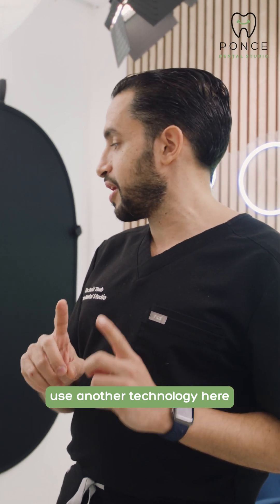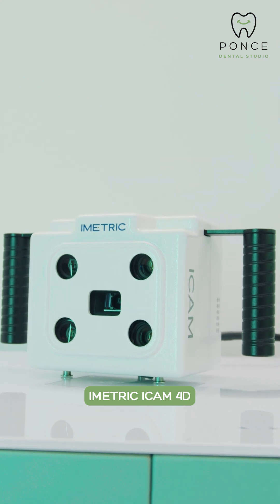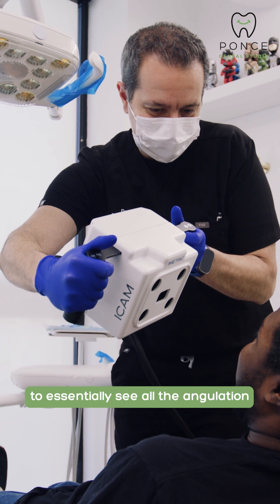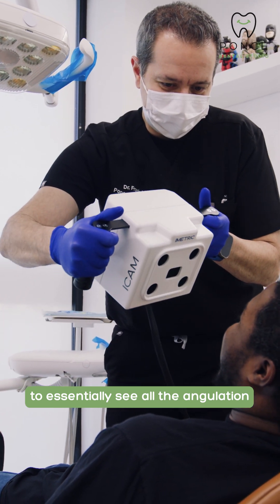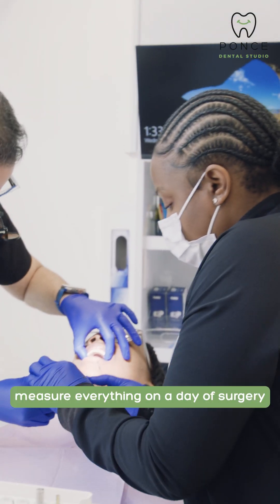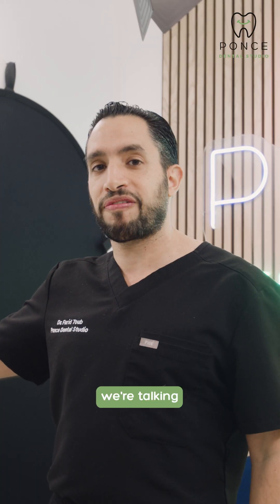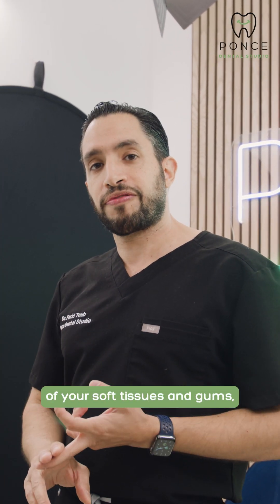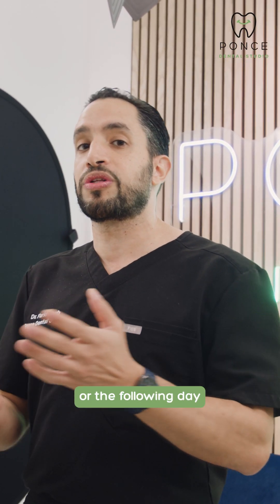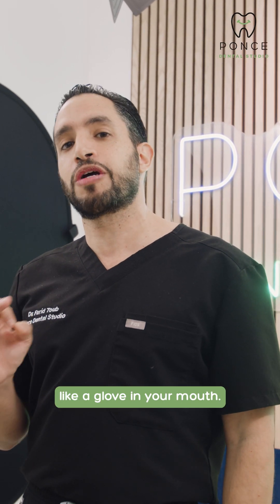We use another technology here that most other places don't have, and it's called the iMetric ICam4D. This tool is going to allow us to see all the angulation of your implants inside of your mouth, and it allows us to actually measure everything on the day of surgery and make our final adjustments. When I say final adjustments, we're talking final adjustments of your implant positions, of your soft tissues and gums, and making sure that the prosthesis you're going to get on the day of surgery or the following day is going to be the perfect, exact fit like a glove in your mouth.